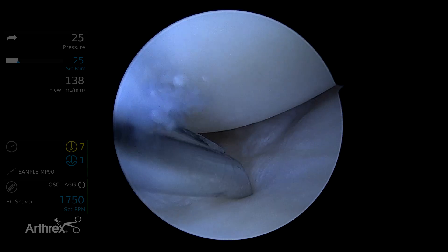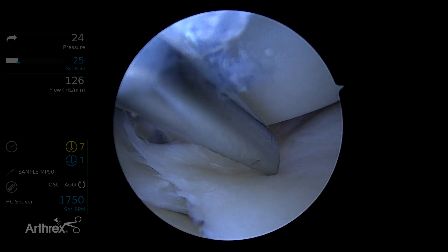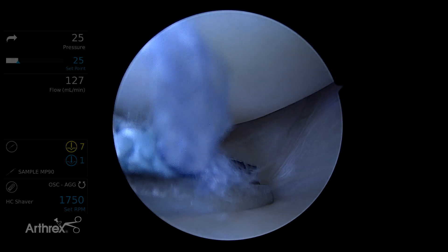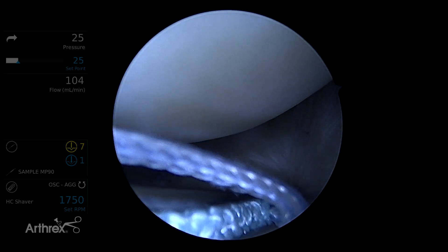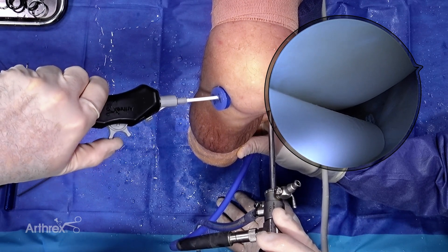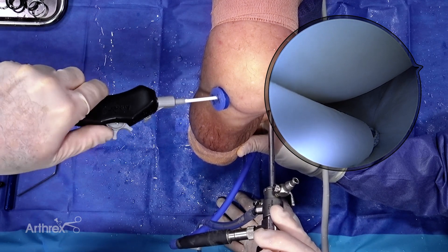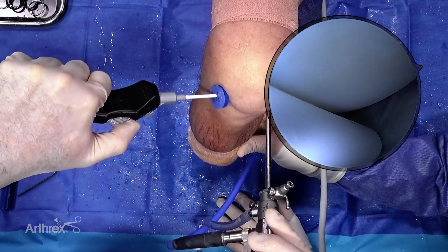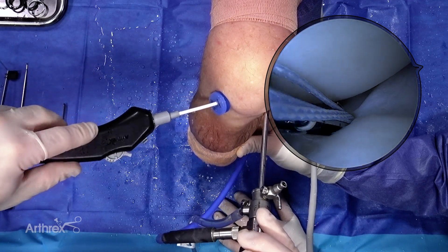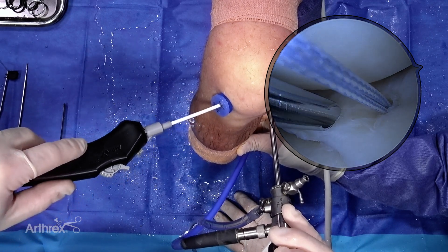Bring our device in. There's my offset from the tear. I can walk a little bit more anteriorly. Get up a little higher at the meniscocapsular junction — good tissue there. I've got the wheel with my thumb. I'm rolling all the way back to the hard stop, then all the way forward, hard stop again. Sometimes you hear a click — that time we heard it nice and audible. Pull that out. You don't have to come out further than you can see; just pull it out and translate right to where you want to go for the second one.